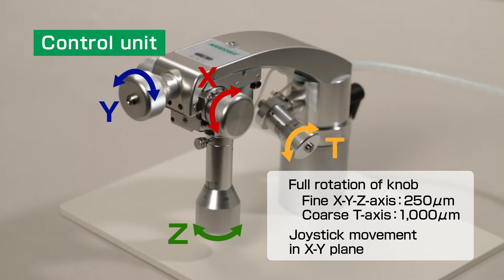The T-axis is a new feature that provides coarse oil hydraulic movement of 1000 microns per rotation. It is used for adjusting the insertion depth of the pipette and temporarily retracting the pipette from the petri dish.